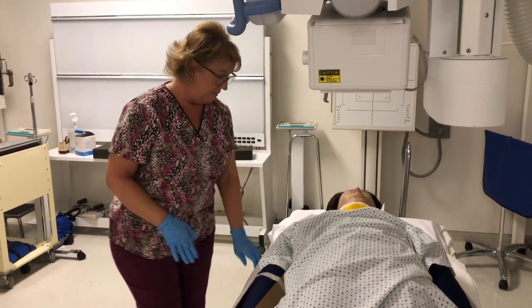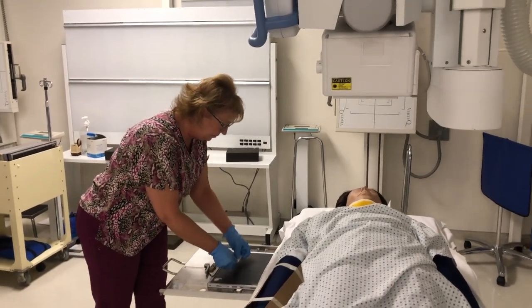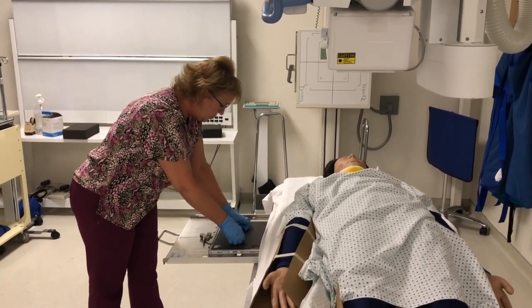All right, so I've done my C-spine x-ray now. I would change out my cassette. I would reset this up for an open mouth x-ray.